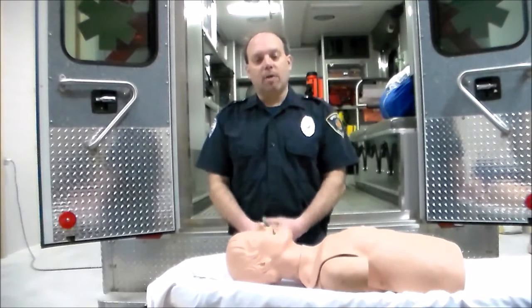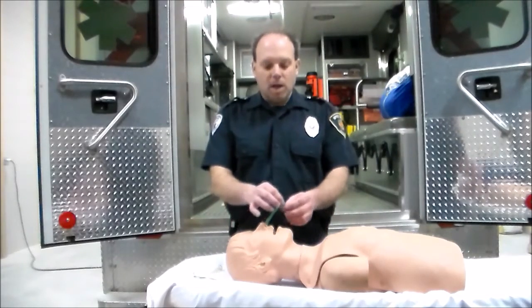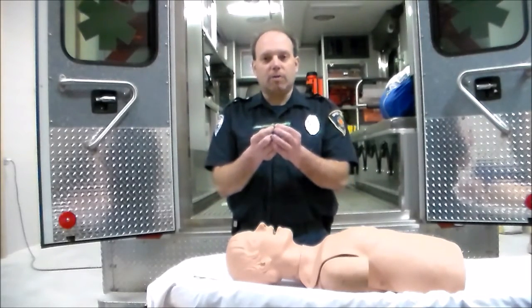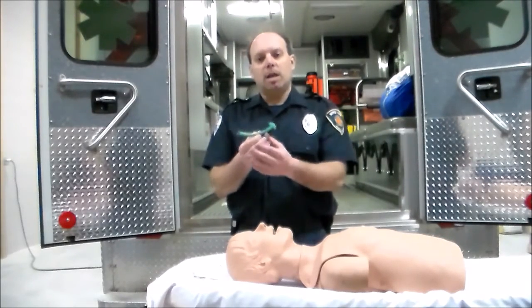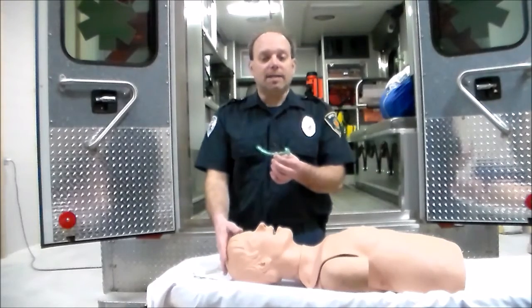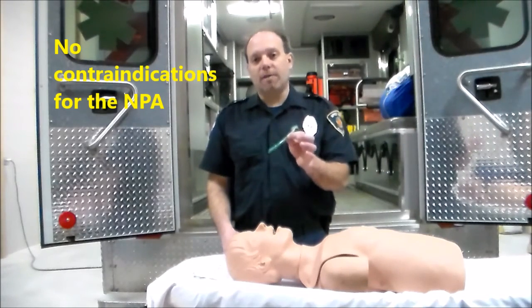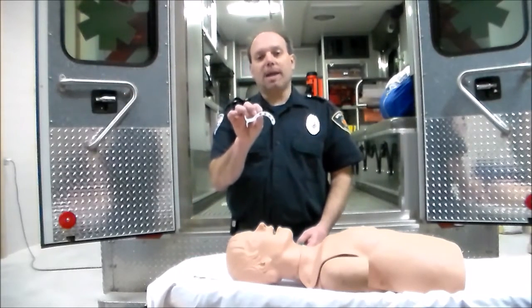We've now secured airways with both the oral airway and the nasopharyngeal airway. Some will cite a contraindication for the nasopharyngeal airway in head injury, but in reality, when we can't access the jaw, securing the airway is critical — otherwise any injury inside the head will get worse. There are essentially no contraindications for nasopharyngeal airway insertion. For the oral pharyngeal airway, the contraindication is a gag reflex.